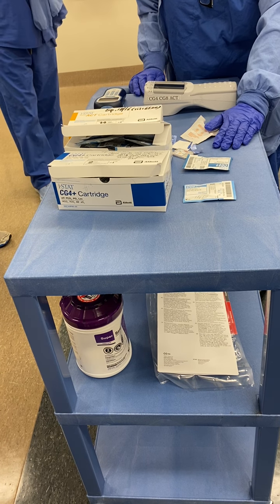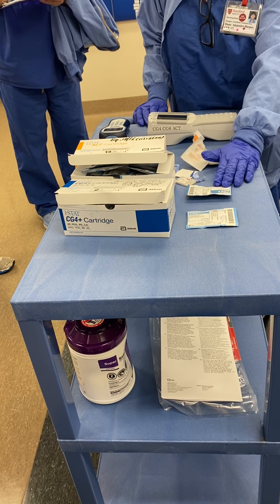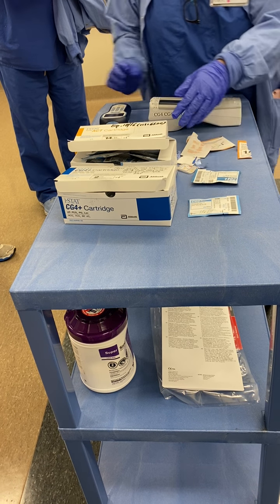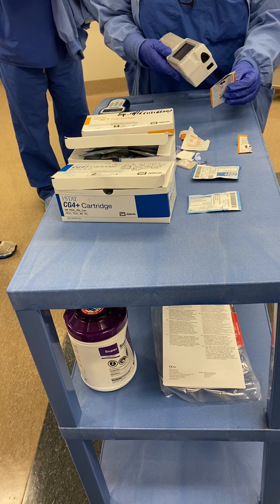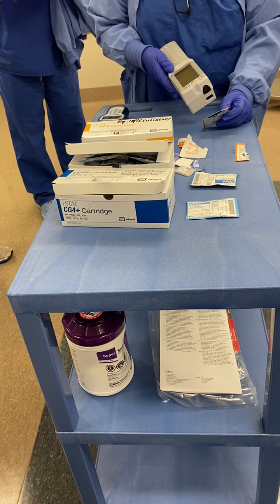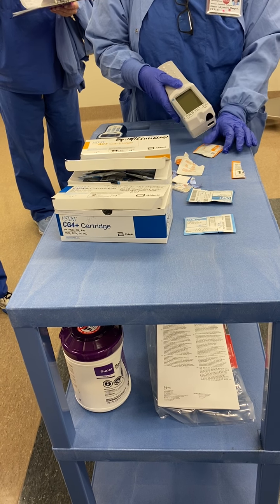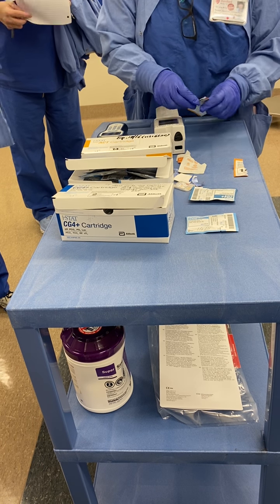one cartridge each because at some point before we end, I'm going to go over all these lab values with all of you. But just to make it very quick, and just to recap, you're going to scan the patient, you scan the barcode, right? And then you're able to get the cartridge.